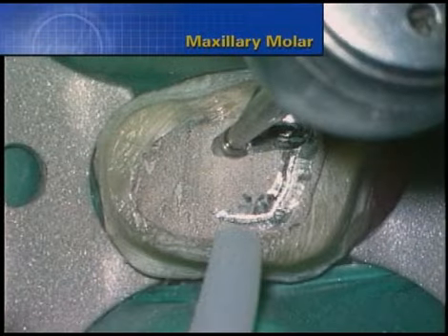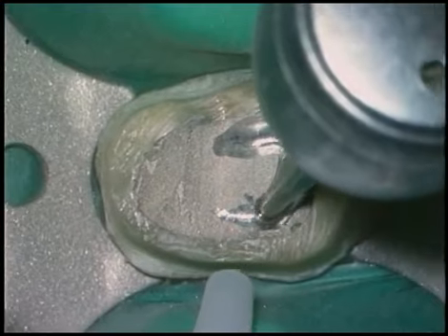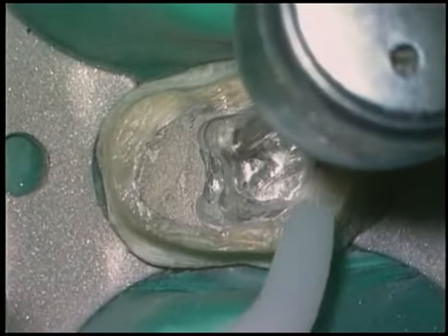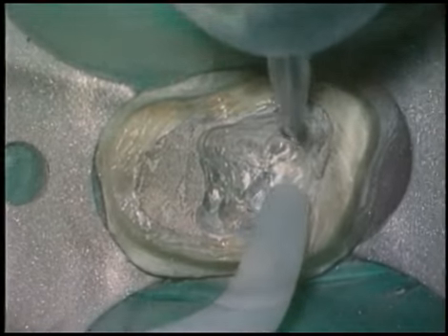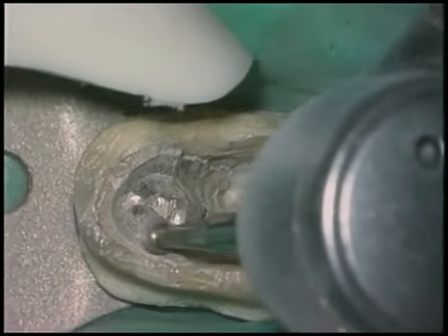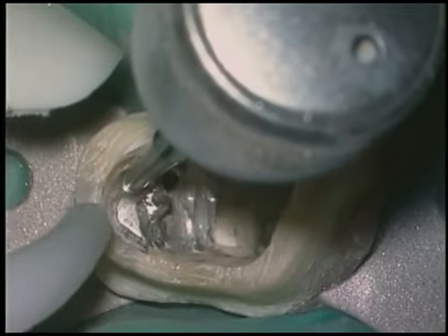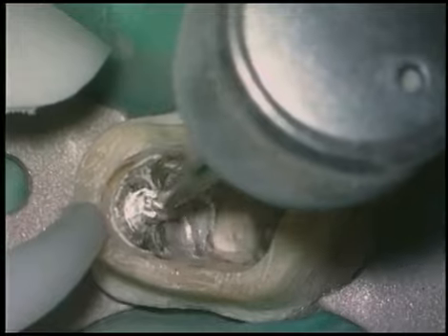In this maxillary molar, the buildup material is an amalgam core. Amalgam cores can be tedious to remove, so simplify the procedure by progressively brushing away this material, being careful to not foreshorten the post. Be careful that you make the distinction between amalgam and post. They're both colored silver, so we could inadvertently and needlessly foreshorten the post.